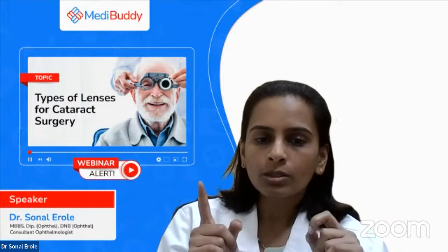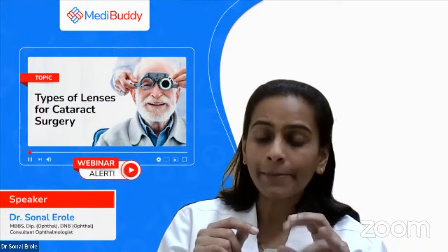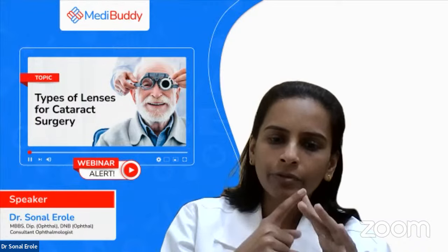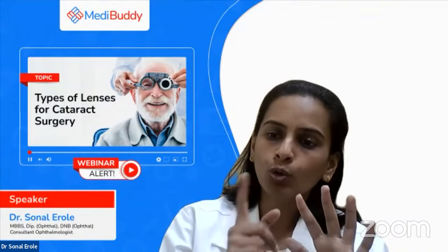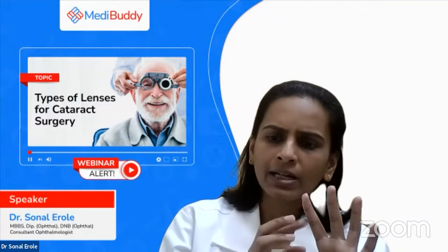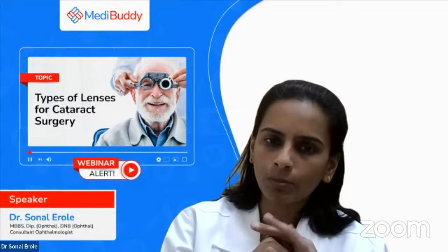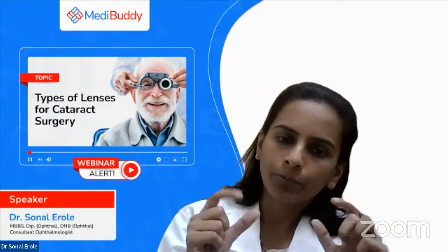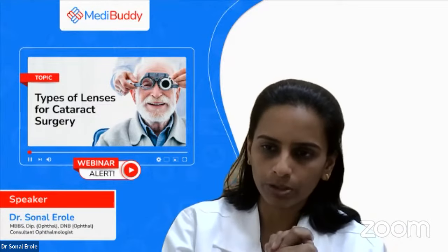So for multifocals to perform best, they should be in both the eyes. If the patient has already suffered CRVO, definitely the retina will be weak. So they can go for good monofocal lenses. And if cataract is to be operated in both the eyes, then good monofocal lenses in both the eyes and glasses for the near vision will be a very good option for this.